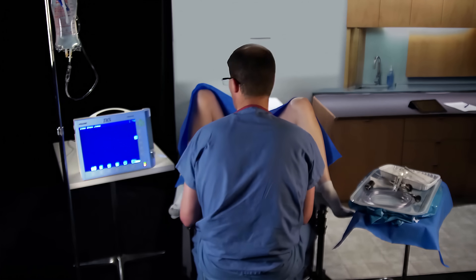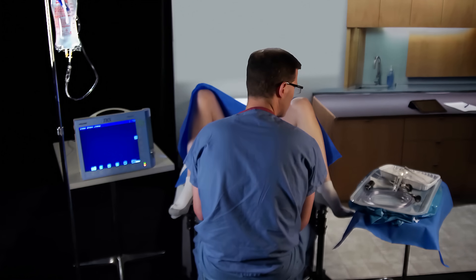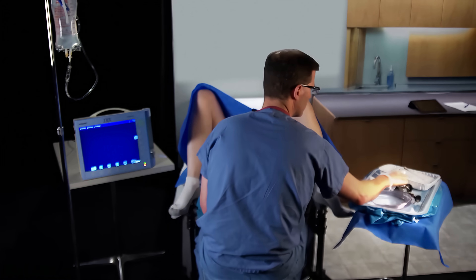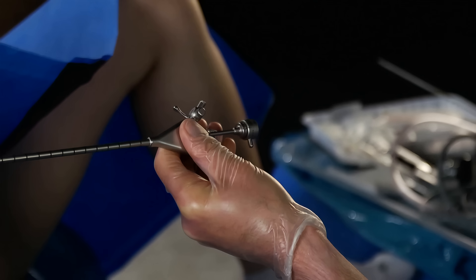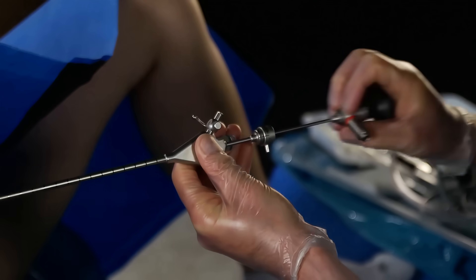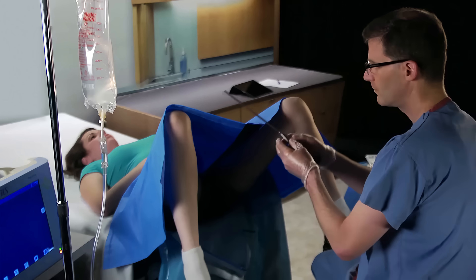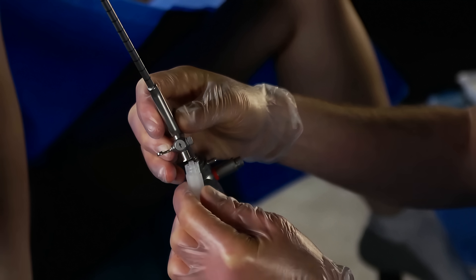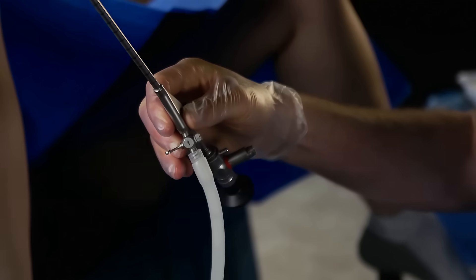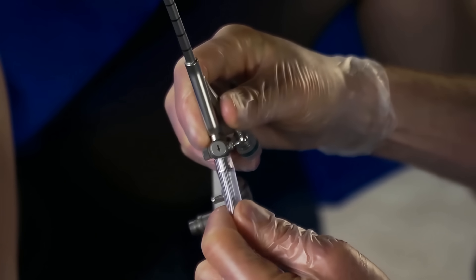For the setup, on one side of the patient is the monitor, the lighting equipment, and the fluid for the inflow. On the other side, immediate to the physician, is a table which is kept sterile for equipment. The hysteroscope is now assembled — it is inserted into the outer sheath and locked in position. The tubing for inflow is then hooked up to the outer sheath. The outflow tubing may be connected to direct suction or directly into the buttocks drape.